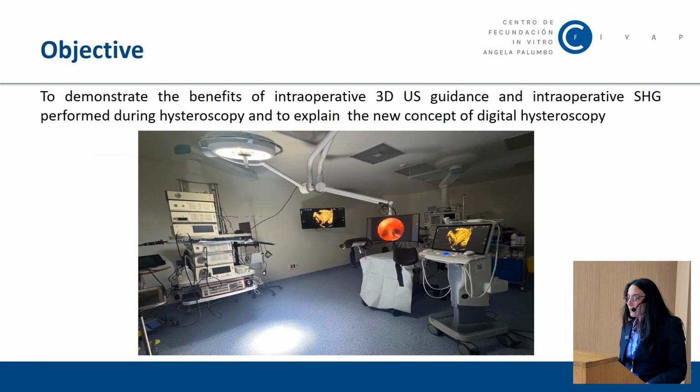The objective of this presentation is to illustrate the benefit of 2D and 3D/4D ultrasound guidance of hysteroscopy and to explain the concept of digital hysteroscopy. Here we see a picture of our operating room integrating 3D ultrasound and hysteroscopy.